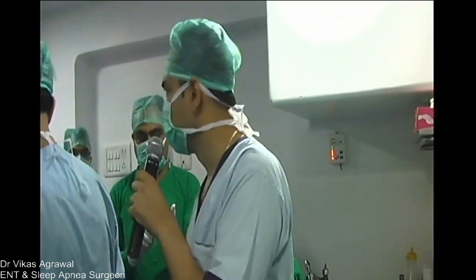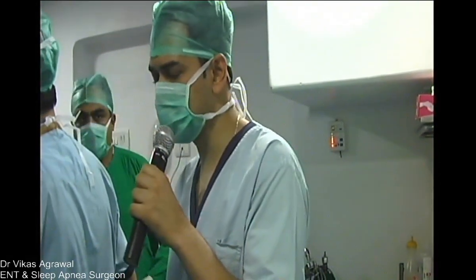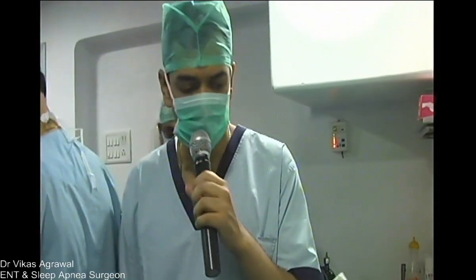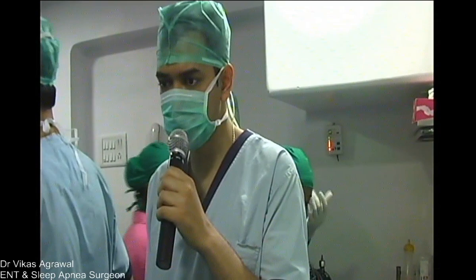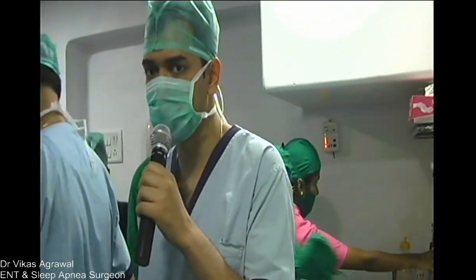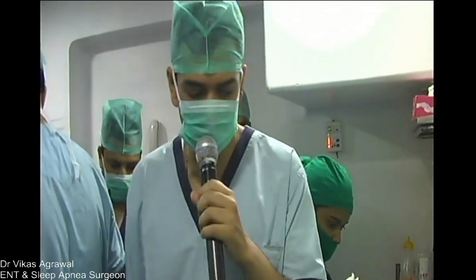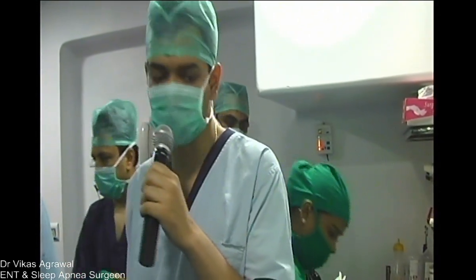Okay. So initially, drug-induced sleep endoscopy is actually a very old technique. It was in 1991 when Croft and Pringle described it. The first drugs which were used were something like midazolam. Now the problem with midazolam was that it's a benzodiazepine, and as we all know, benzodiazepines are respiratory depressant drugs.